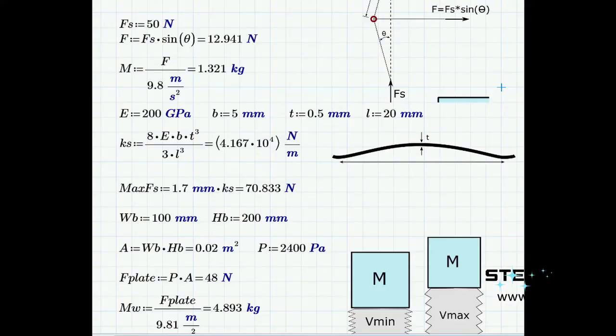Calculations concerning the tidal volume, pressures in the system, how the toggle valve will work, and other mechanical calculations have been done to verify its feasibility.